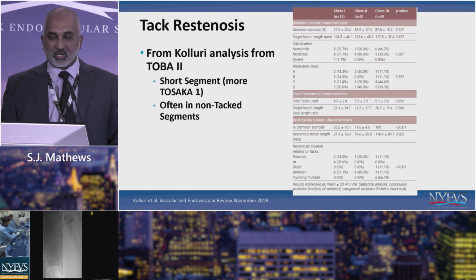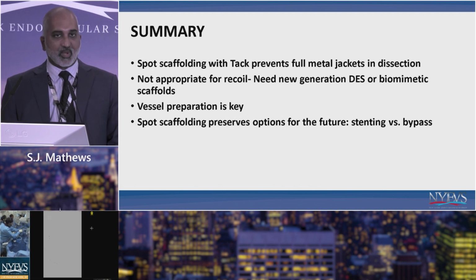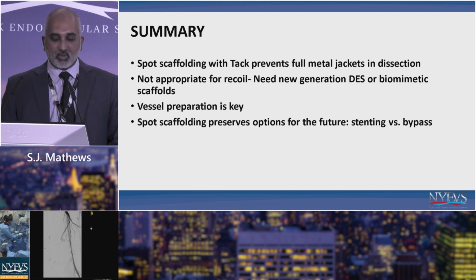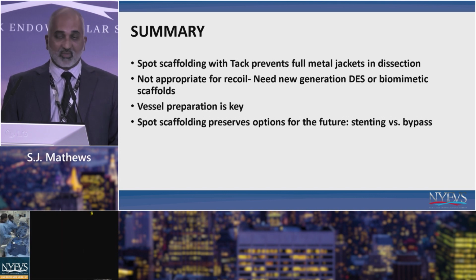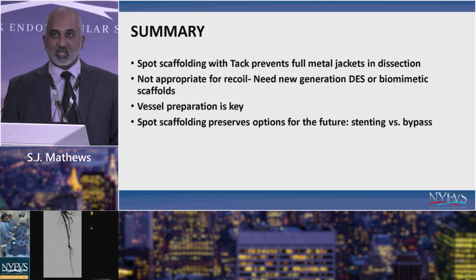And at that point, you can treat them any which way you want. If you want to do laser and drug-coated balloon therapy after the fact, that certainly can be done, and it is easily addressed. So vessel prep, I think, is very key for these kinds of things to decide. If you don't do vessel prep before you decide which way you're going to go, whether it's spot scaffolding versus stenting, then you're going to end up with very poor results. Ultimately, folks who just tend to do ballooning tend to have a lot more stenting in general. So I think there is a role potentially for atherectomy solutions, debulking therapies, and potentially drug-coated balloons in combination with these spot scaffolds as well.